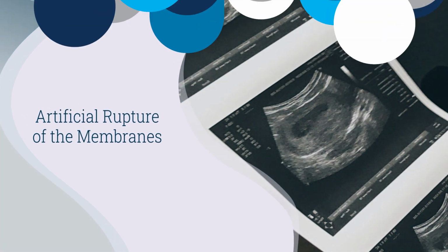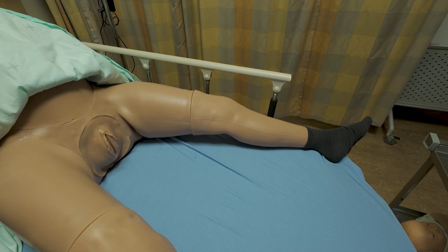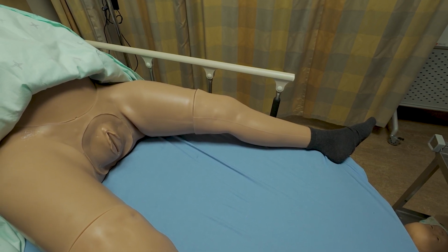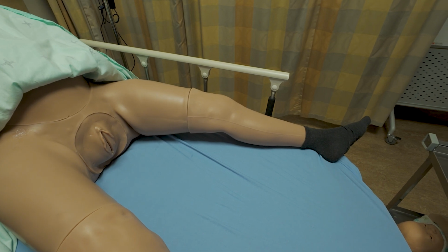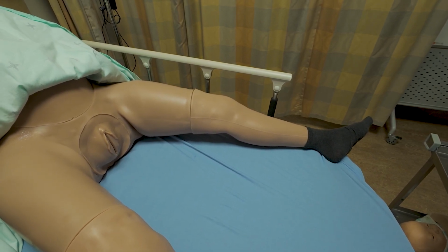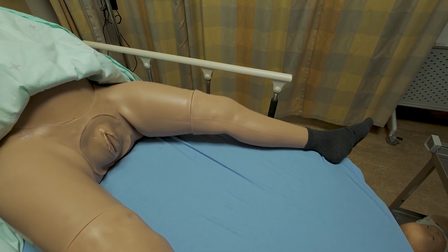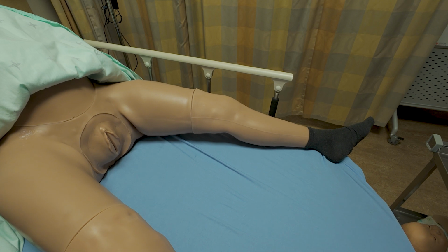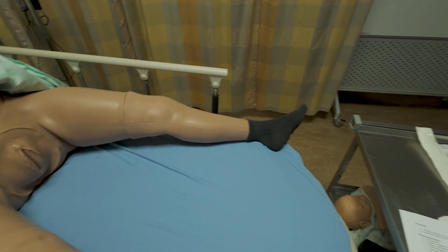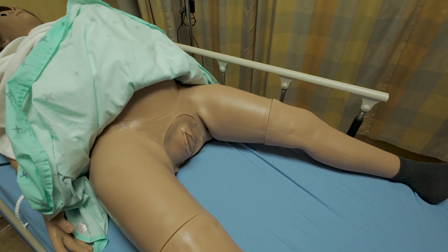Our demonstration right now is the AROM, or Artificial Rupture of Membranes, demonstration. Soon after that, we're just going to do an application of a fetal scalp electrode for fetal monitoring. So in this situation, we need to rupture our client Victoria's membranes and then apply a fetal scalp electrode to closely monitor the baby. Before we get started with AROM, we can do a review.